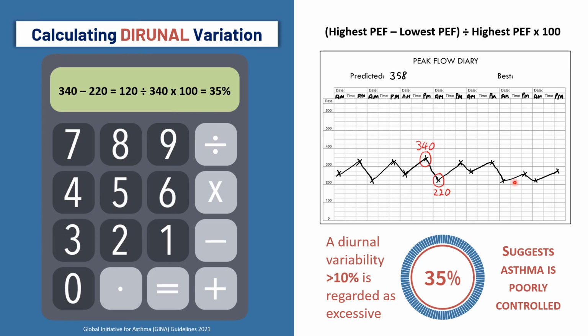Would you take a fasting sugar off a patient who came in and said, "Oh, I'm sorry I'm late, I called in Starbucks for a muffin"? You'd say, "Well, I'm sorry, but I can't take it." If you were handed a urine sample for, say, albumin and creatinine, and the patient said, "Oh, I've just been doing my 5-mile morning run, I'll just go and do my sample," you'd reject that. And equally, we have to reject any data that might not be accurate in asthma.